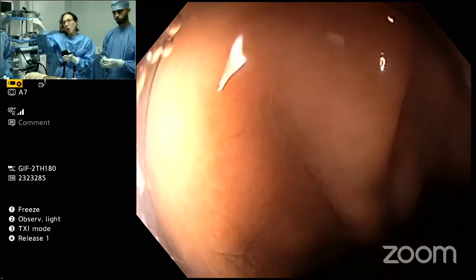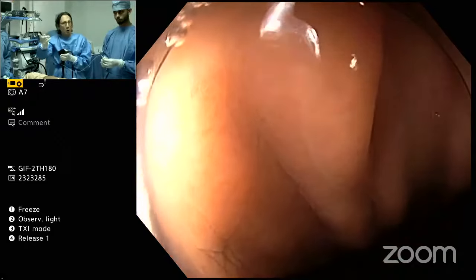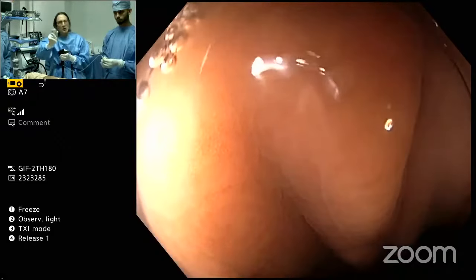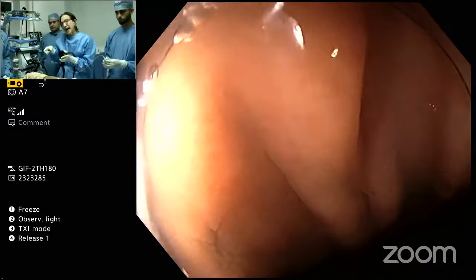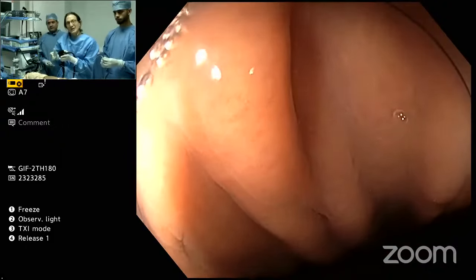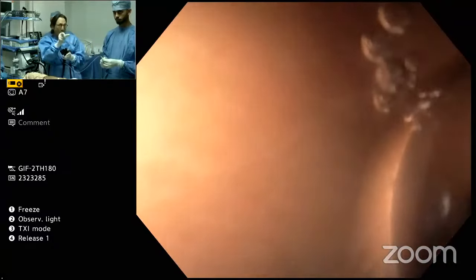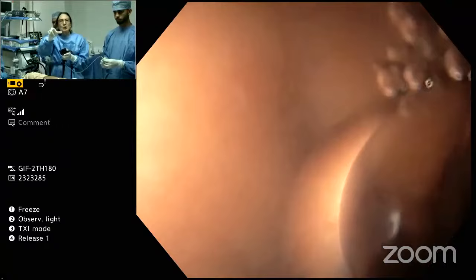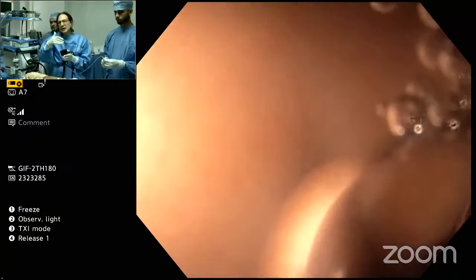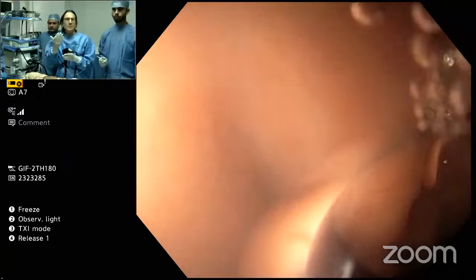So you've got the one edge, let's say the distal end, and they are color coded. There's a gold and a silver, so you can differentiate. And on the handle, you can close the prongs relative to the post, independent of one another. Then you go to the opposite side, you open up the other prong against the post in the middle, and then you bring the two together. So these are all improvements, incremental innovations of the basic clip.